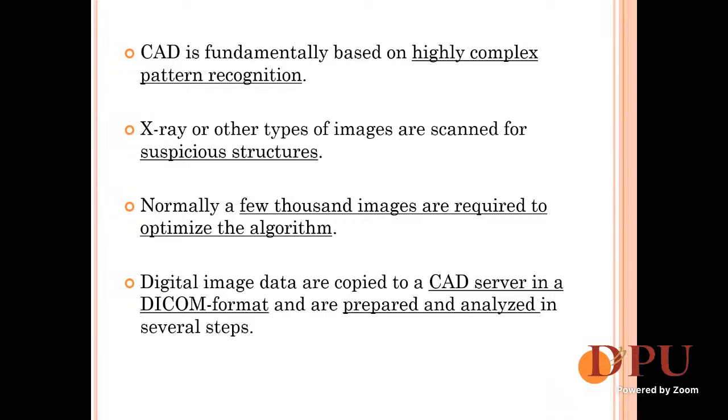Now, talking about this CAD system, what it actually is, is nothing but a typical pattern recognition problem. Whenever we talk about a pattern recognition problem, it deals with a stored pattern, and we try to identify, for a new pattern, whether there is any similarity or dissimilarity between the two. Say, in an X-ray image, if there is a hairline crack, we try to identify if it is suspicious or not.